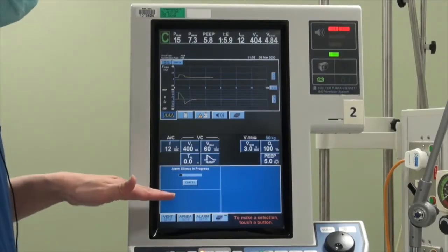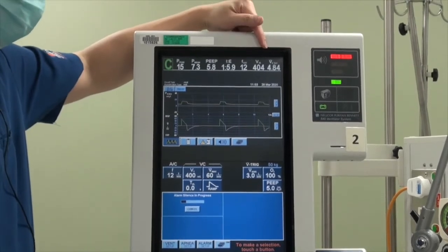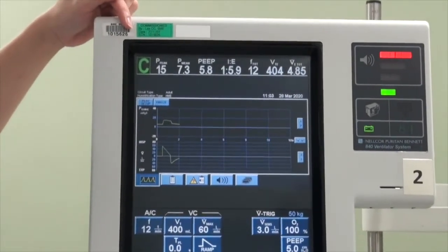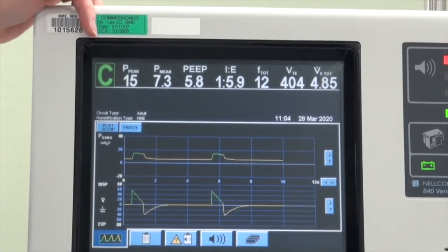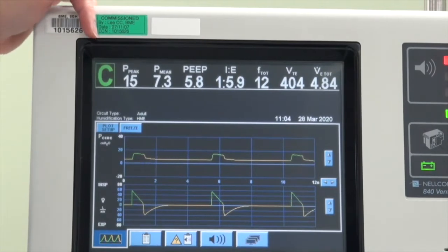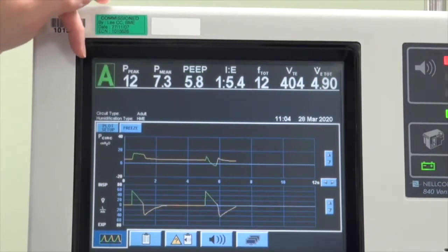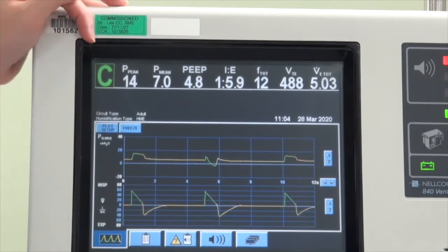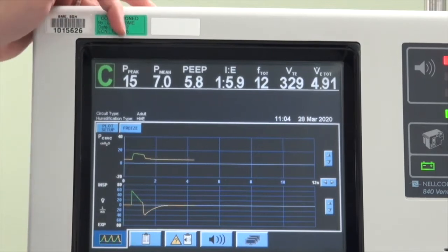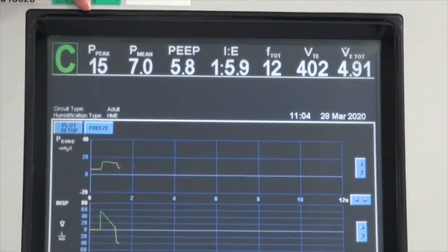Once we have programmed in the parameters for the patient, you will notice that in the top bar there is a set of parameters measured from the patient. The first letter you see is 'C', which stands for controlled and is shown in green — this means the tidal breath delivered to the patient is initiated by the ventilator. If this is a spontaneous effort, it will turn to 'A', meaning it is an assisted breath triggered by the patient and fully supported by the ventilator. The next reading is the peak airway pressure, which tells you the total airway pressure of the patient and reflects the degree of airway trauma the patient may experience if it exceeds a certain limit.